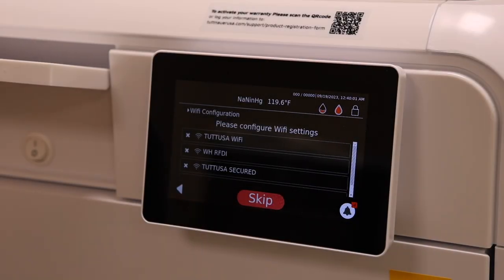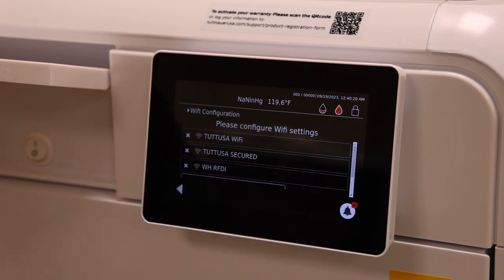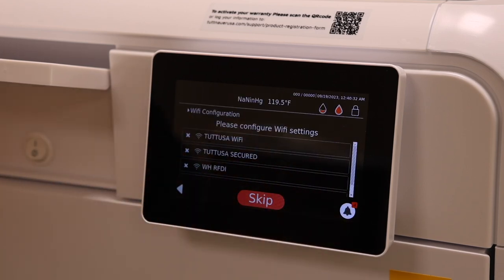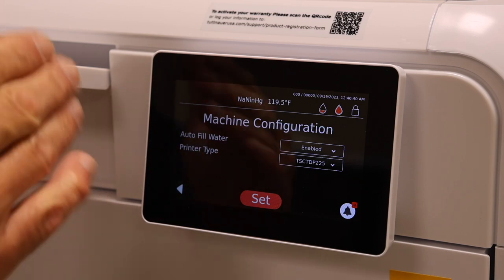Next we set up the WiFi configuration. This is very important — it's what allows T-Connect to remotely monitor the machine, provide technical assistance, and read all cycle history. Choose your WiFi network, enter the password, and set it up. In our example it's already configured, so we'll skip ahead.